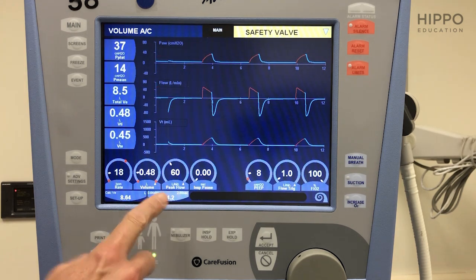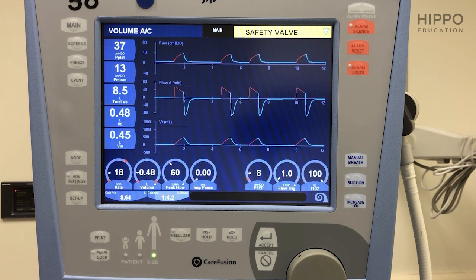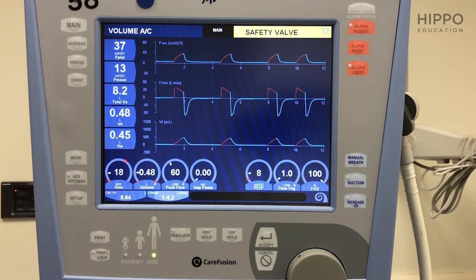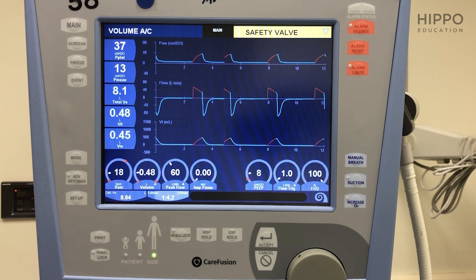The next one is peak flow — that's not one of the four essentials. But remember your peak flow is usually 60 to 80, sometimes up to 100, and that's really giving the amount of air to that patient. If they look like they're air hungry or stuck on the tube, you might want to bump that up. But in general, just leave that at the set rate for the machine.